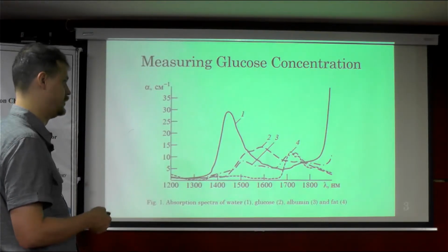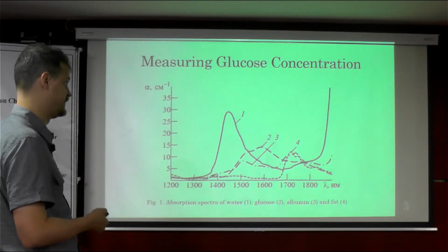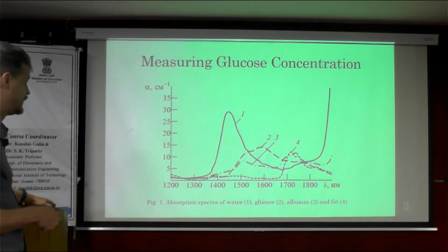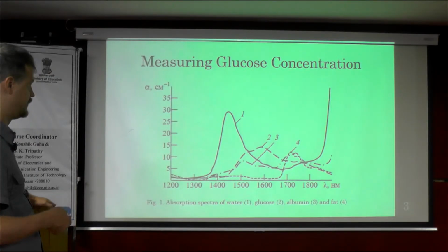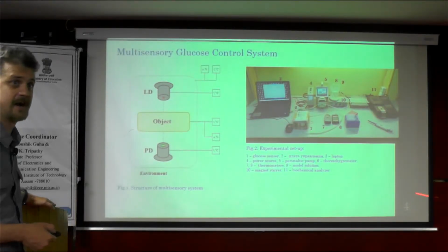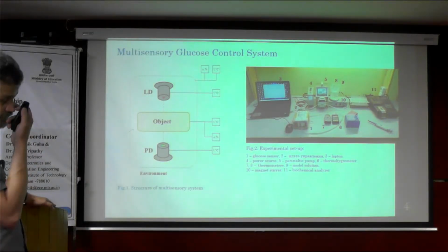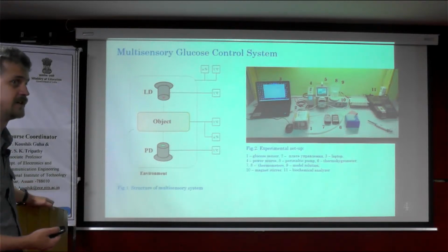That's the type of fluid that dissolves any substrates and works as a form of transportation of this solid in the blood system. So basically, the main idea revolves around this optical approach. And that's the implementation in the laboratory setup, how we can implement this particular system. So basically, this is a type of sensor that can potentially be obtained and adapted to the implantable artificial kidney.